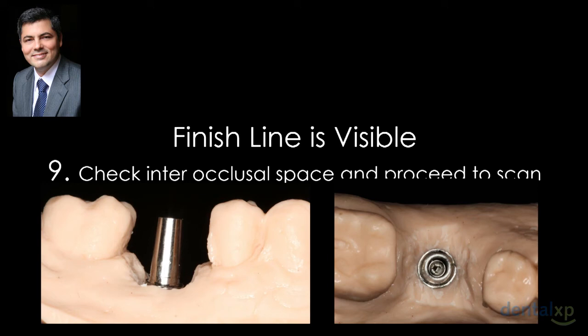See, you're going to have a very nicely exposed finish line that your scanner is going to be able to capture. So now you are not fighting inside the mouth. The patient doesn't have to be for a long time with an open mouth. You don't have to be repeating scans. The crazy work is out. You just pick it up, take it to your lab, right in your office, and do the work that you need to do. Simple.